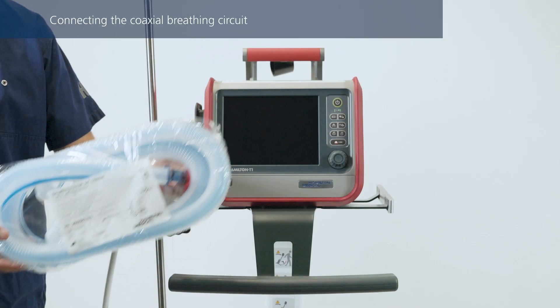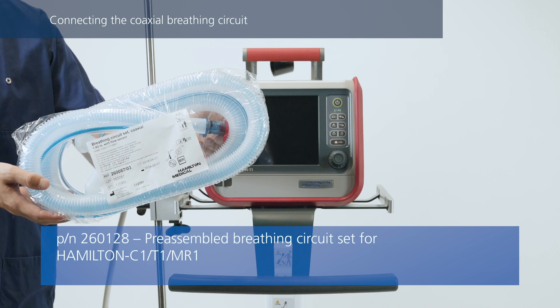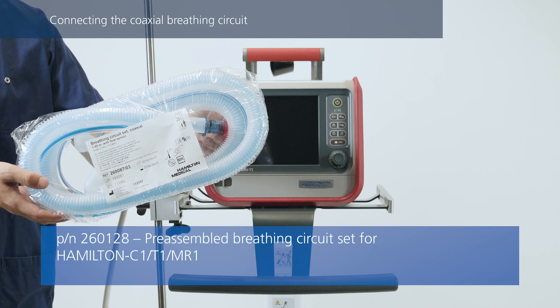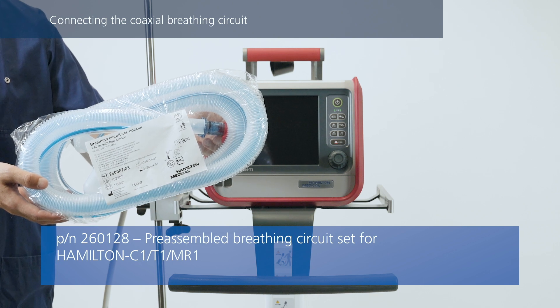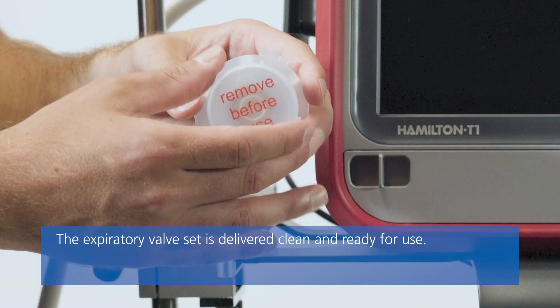If you are using a pre-assembled coaxial breathing circuit, this contains everything you need, namely the expiratory valve set, the breathing circuit, and the flow sensor. Be sure to check the expiratory valve set before using it on the patient.